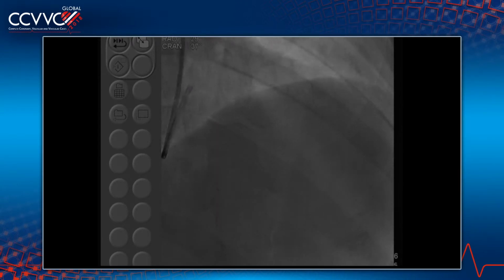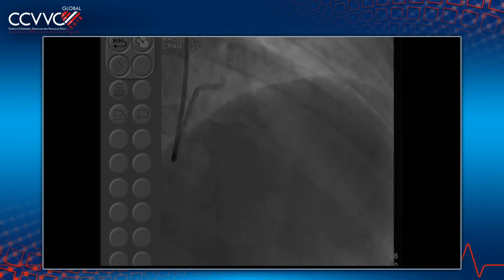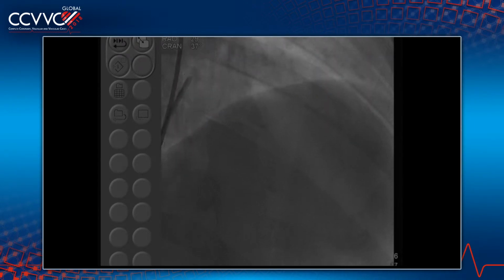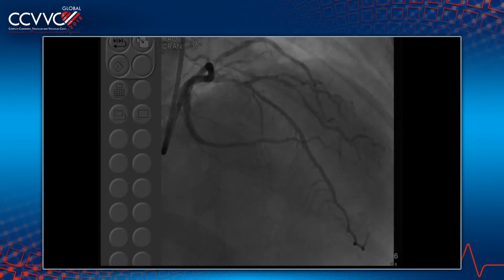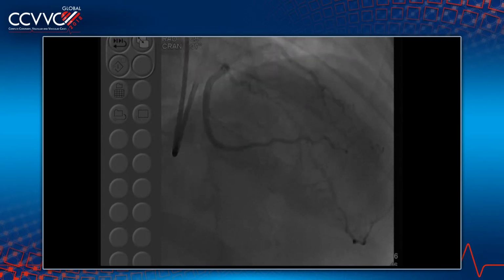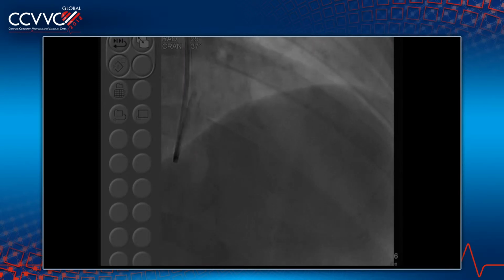It's 80-90% at the diag ostium. So I think if they can start showing us the bifurcation, that's where you make a decision. If your side branch is more than 70%, and the length of the side branch lesion is definitely more than 10 millimeters, and the size of the side branch, like you see here, is 2.5 and larger, you have to consider a 2-stent strategy, and that is what we are going to do here.